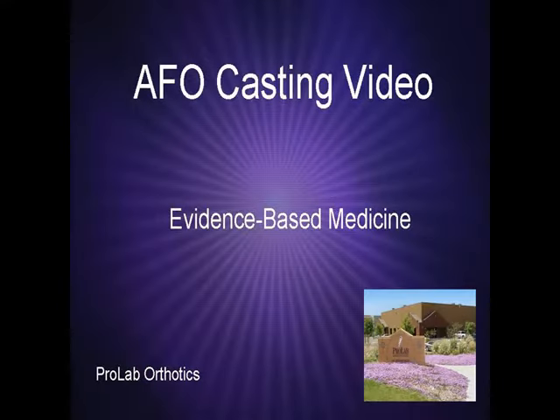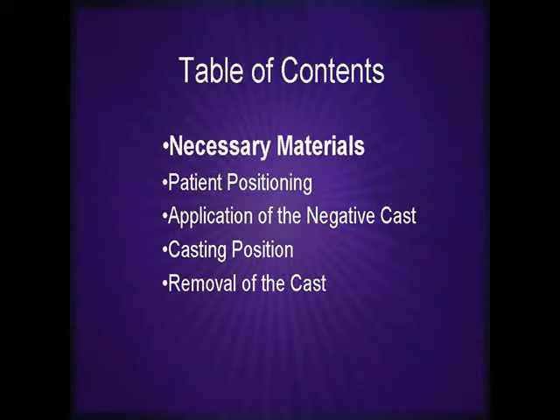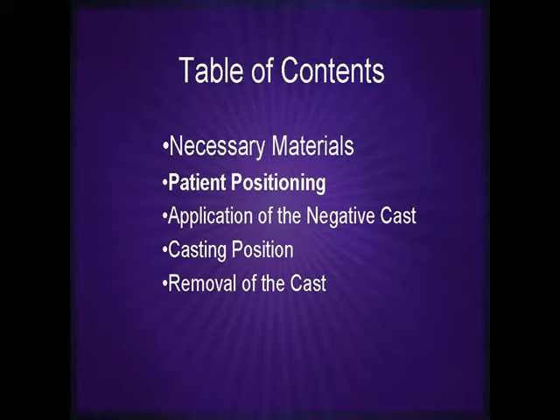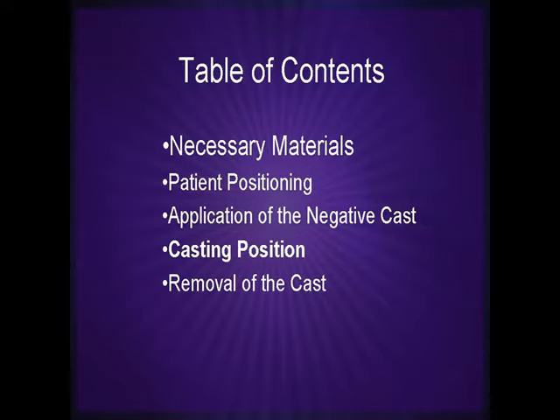The purpose of this video is to give the clinician proper instruction in creating a negative cast for use in fabricating an ankle foot orthoses. This video will include the materials necessary to create the negative cast, how to position the patient, application of the negative cast, positioning of the foot, and removal of the cast.